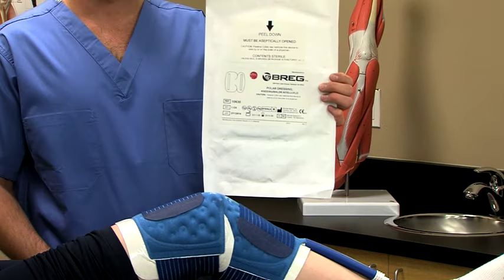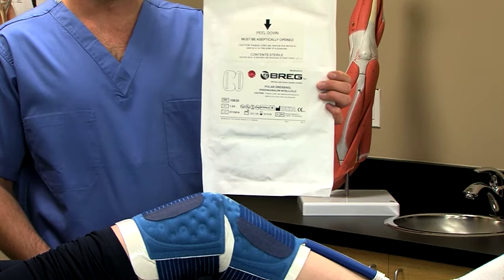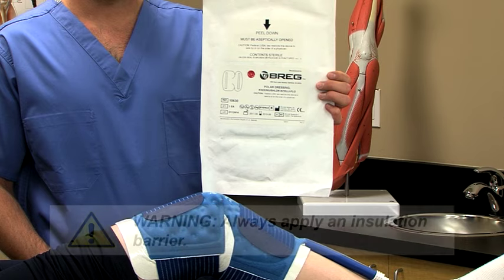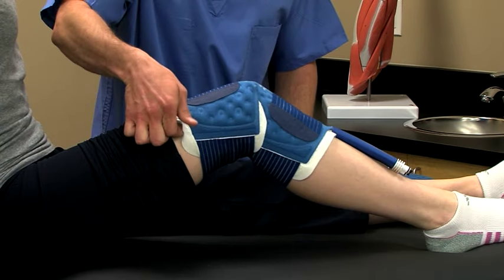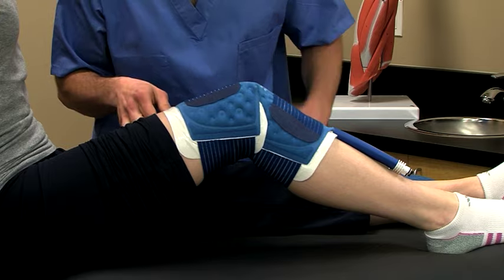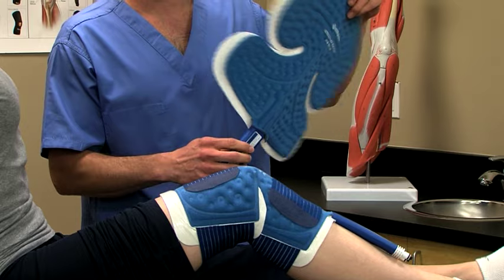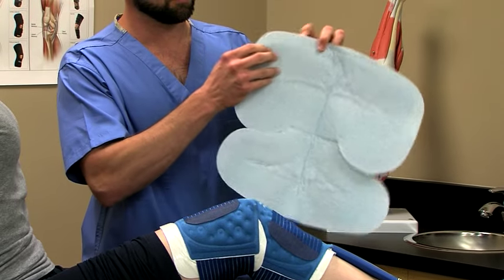To apply the pad, always use an insulation barrier like a Breg Polar dressing, Webril, Kerlix, cast padding, or an elastic bandage between the pad and the skin. Don't let any part of the pad touch the skin directly. If the patient is wearing a sterile dressing that doesn't completely cover the skin under the pad, use an additional barrier.